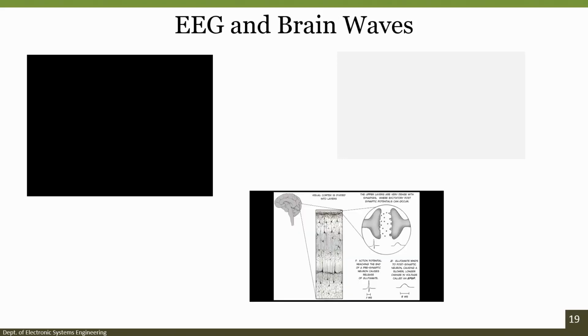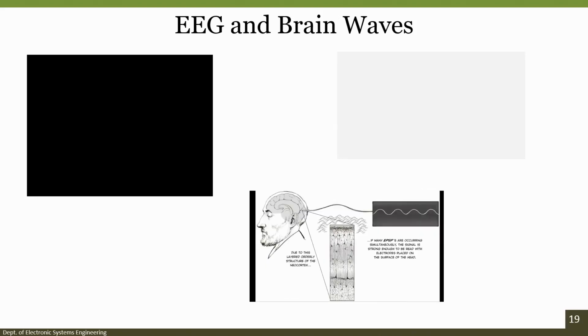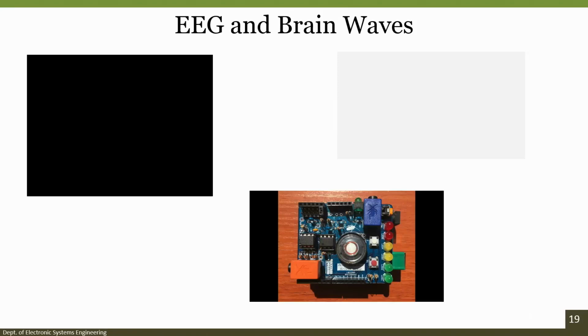The physiological underpinnings of the EEG signal are complex and still a topic of active investigation in the neuroscience community, but we currently understand it to be the summed activity of many synapses in the upper layers of the cerebral cortex. Our heart and brain shield thus amplifies the electrical activity of these synapses such that we can view them on a computer under the appropriate conditions.